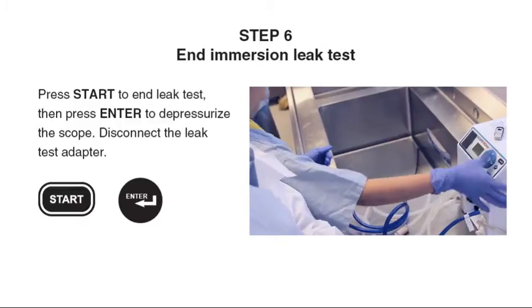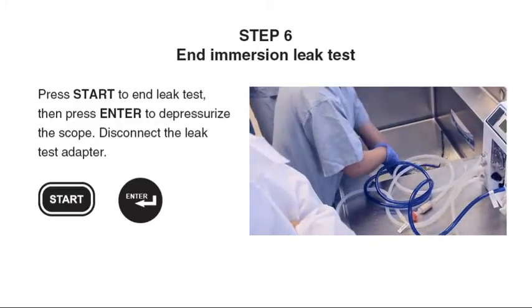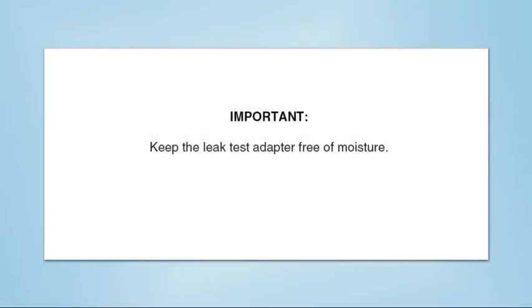Step 6: Press Start to end the leak test, then press Enter to depressurize the scope. Disconnect the leak test adapter from the scope. Keep the leak test adapter free of moisture.